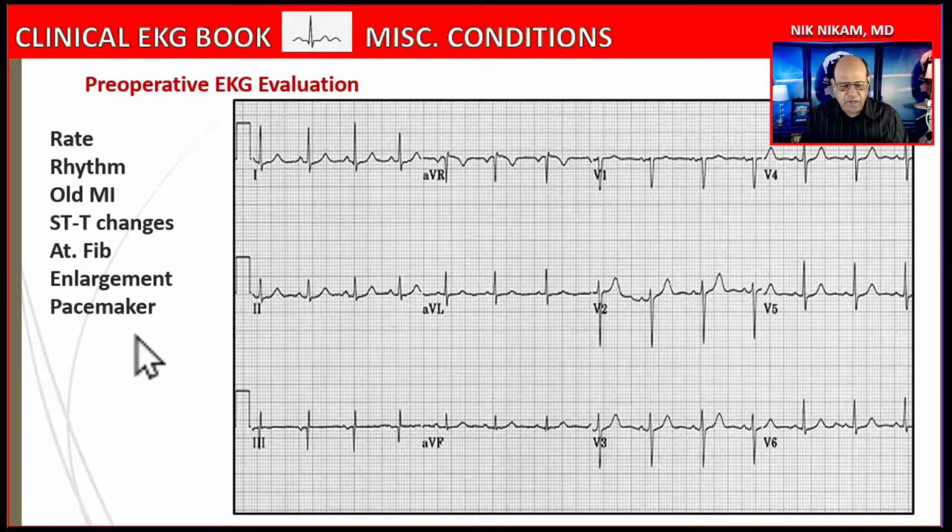No. If the patient has a pacemaker, that's going to make a whole lot of difference. What kind of pacemaker is this? Does the patient's pacemaker need to be put on a fixed rate? It's better to get the pacemaker evaluated before this patient goes for surgery, especially if it's a major surgery, and the pacemaker may have to be programmed depending upon the type of the surgery. Are they going to be using cautery near the pacemaker battery site? Do you need to protect the pacemaker from getting these electrical signals from the electric cautery?